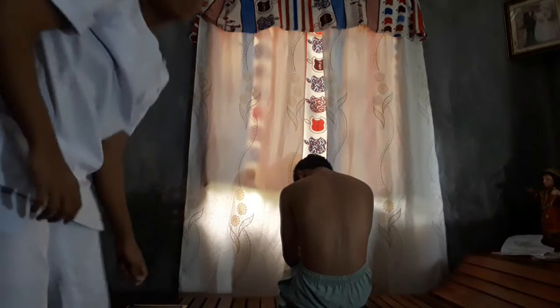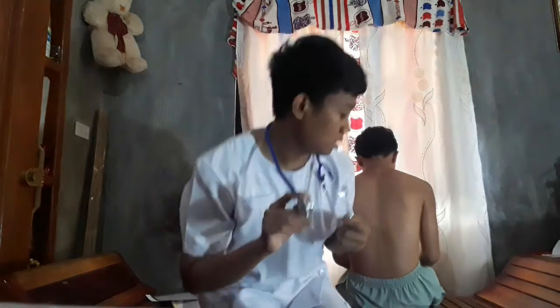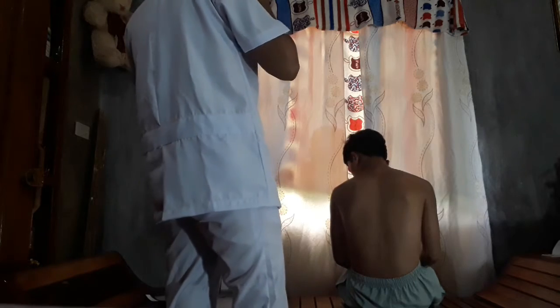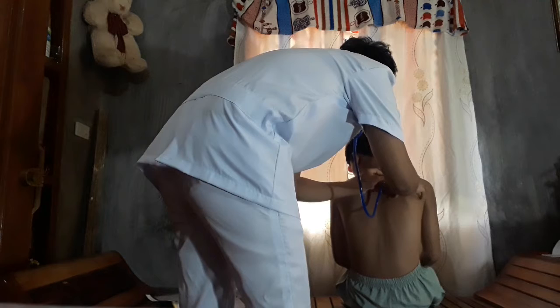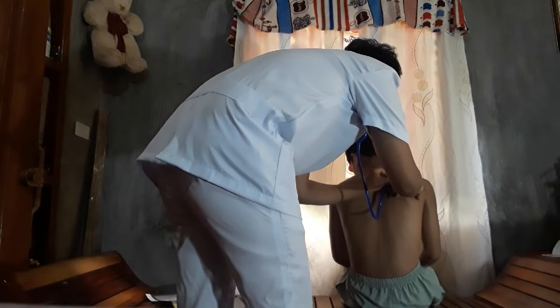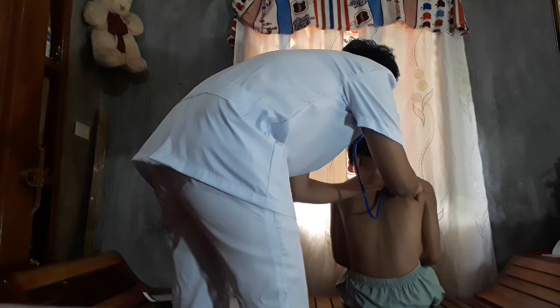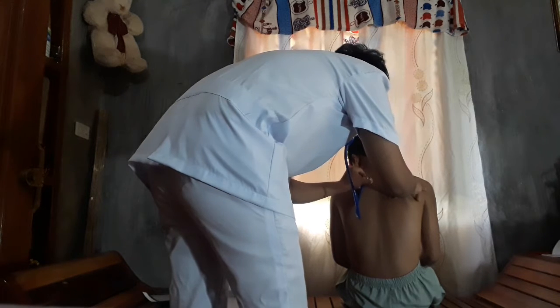Thank you, sir. Next is to auscultate the chest using the diaphragm of the stethoscope. Ask the client to take a slow and deep breath using his mouth. Inhale, sir. Through the mouth, sir. Inhale, exhale.